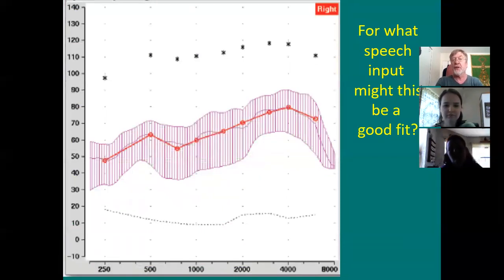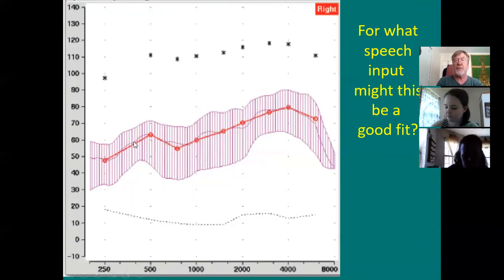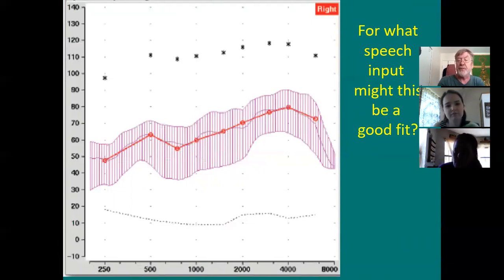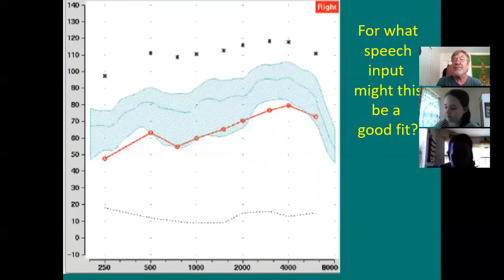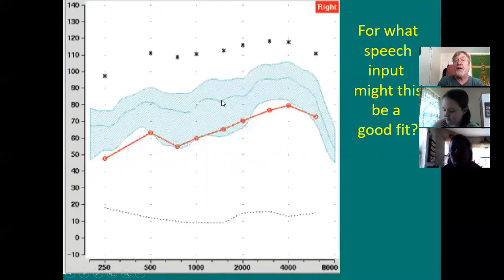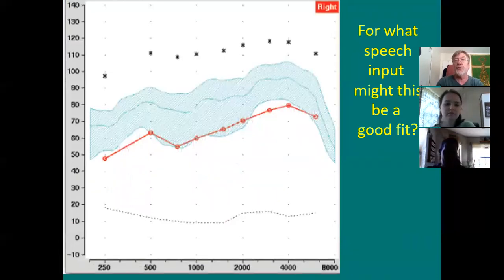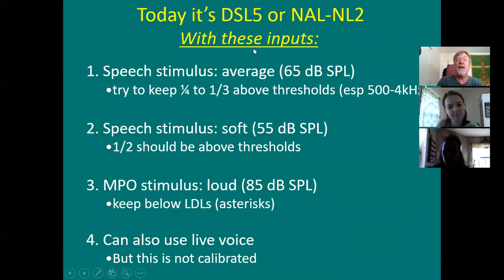For what speech input might this be a good fit? Soft — because the speech is barely audible. Some of it is audible, you can hear pieces of it. The purple or pink is surrounding the thresholds. But if it were average inputs, you'd want this. Even this is maybe a bit much, but you're at least about a third above the thresholds. So again — if this is for soft, this might be what you'd want for average. And for loud, you'd want maybe a little bit higher.